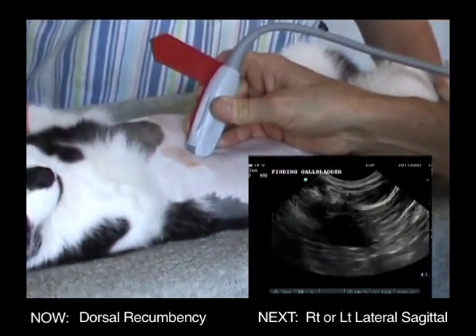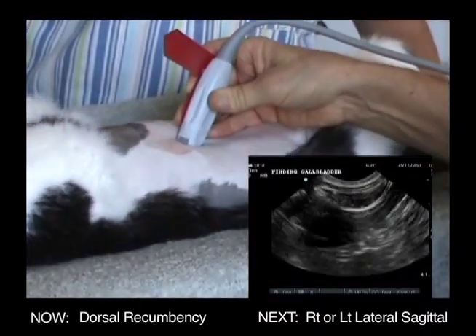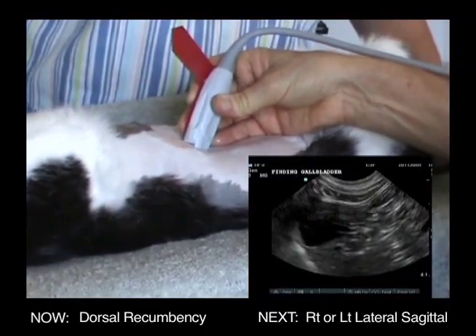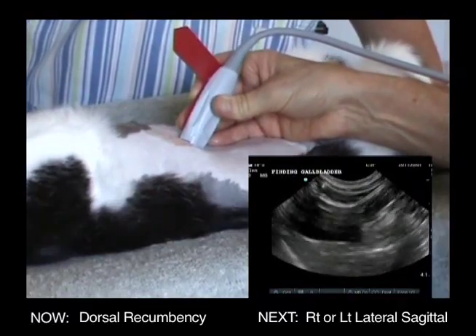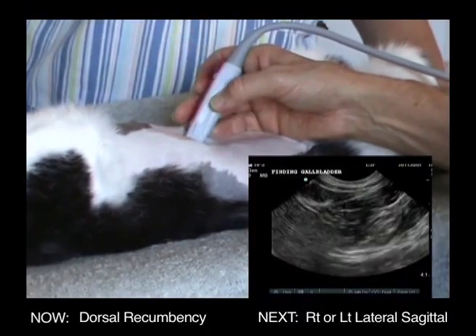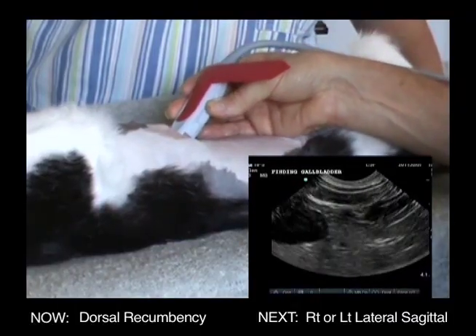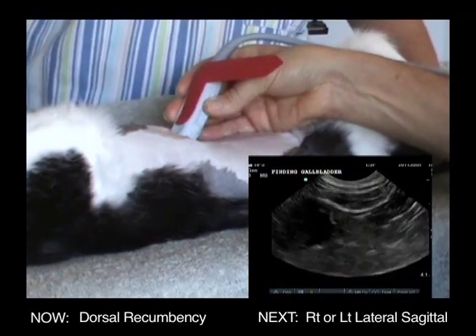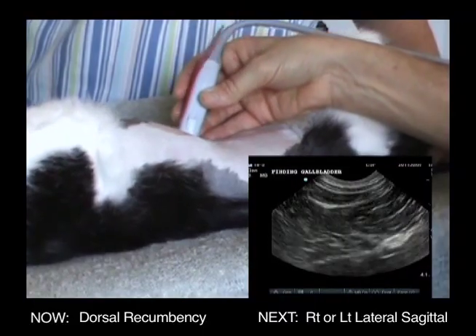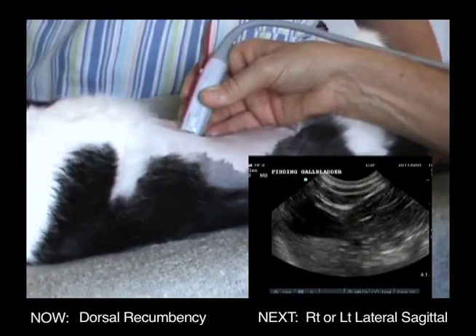Unfreeze the ultrasound machine. Fan the transducer slowly to the patient's right side till the gallbladder disappears. Then reverse directions and fan to the patient's left till the gallbladder disappears, to be sure you have seen all of the gallbladder and its contents. If I see or suspect a lesion of the gallbladder, I rotate the transducer to a transverse position, fan cranially, and then caudally to see all of the gallbladder and confirm a lesion in a second view. Then I rotate back to a sagittal or long axis position.